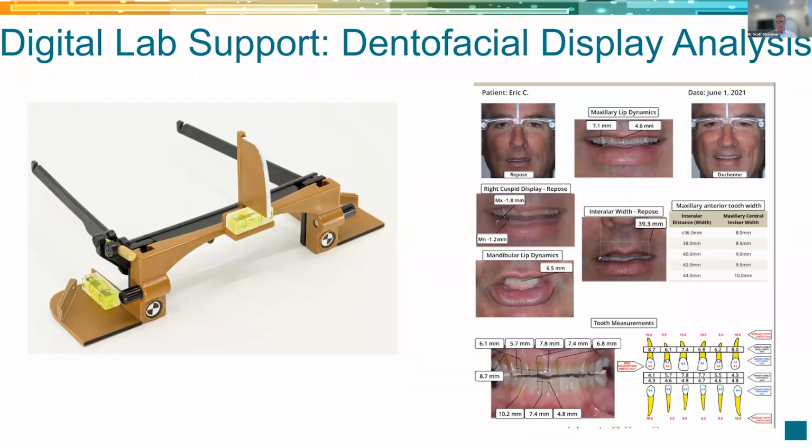So in this case, we're going to use something called dental facial reference glasses. This is all about having the patients use these glasses with some photography, and then we'll throw in a nice scan with our Prime Scan, and I'll be able to get lots of data and information that used to be really tedious to get. So these glasses, I don't quite have enough time to go into it, but it's about natural head posture. We put these on, you can see these actual little black and white markers here. They have a distance between them.